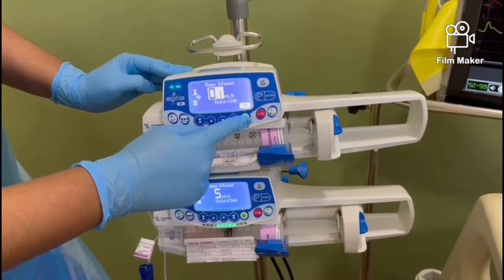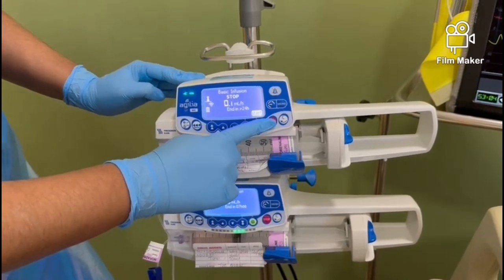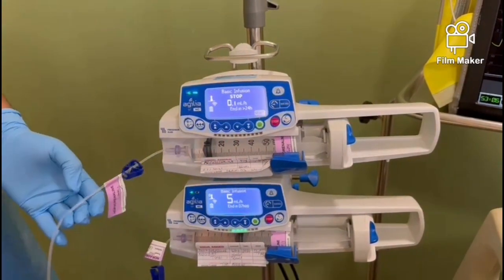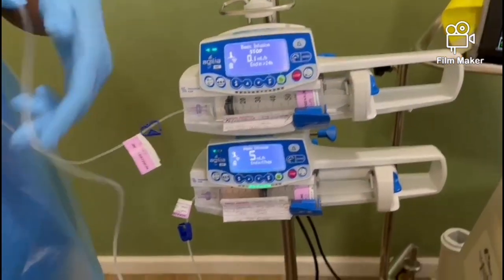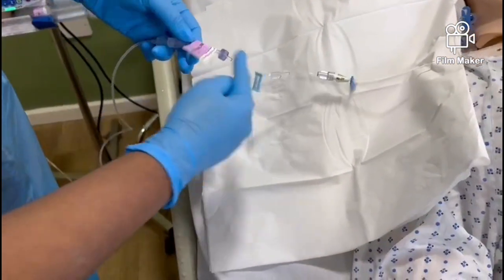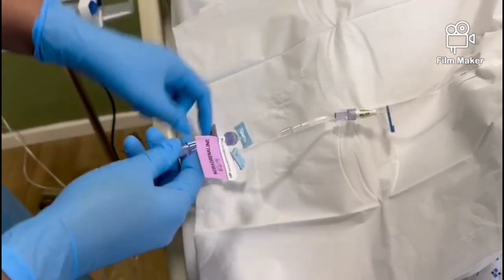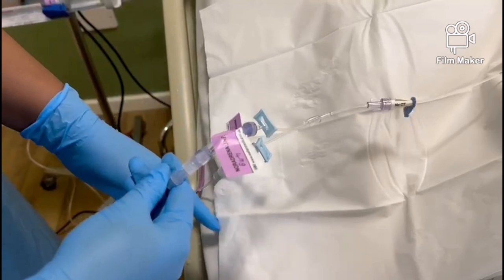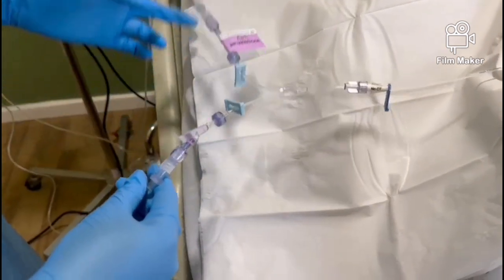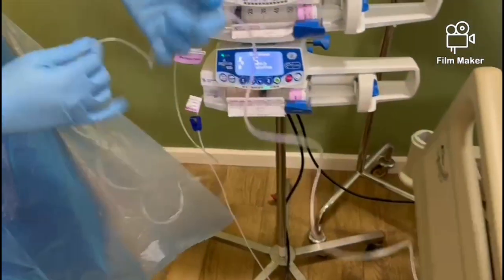Once we have managed to wean down the old noradrenaline infusion, the lowest rate we can go to is 0.1. Stop your infusion. Follow the line back to the octopus port no longer in use and clamp the line. You will also need to engage the clamp nearest the syringe. Follow the line back down towards your syringe to ensure you employ the correct clamp.